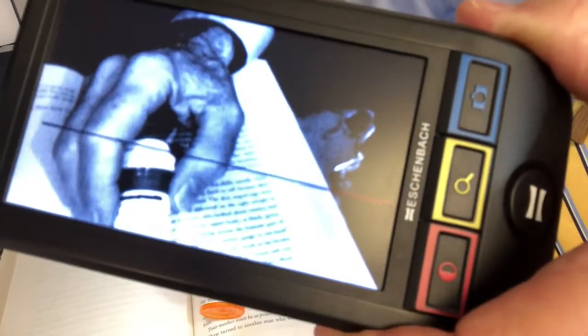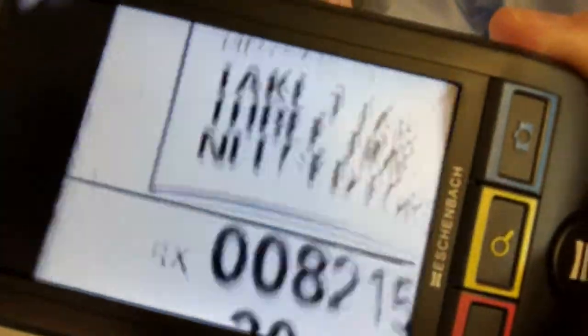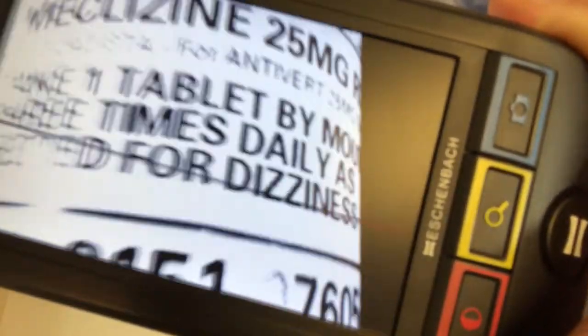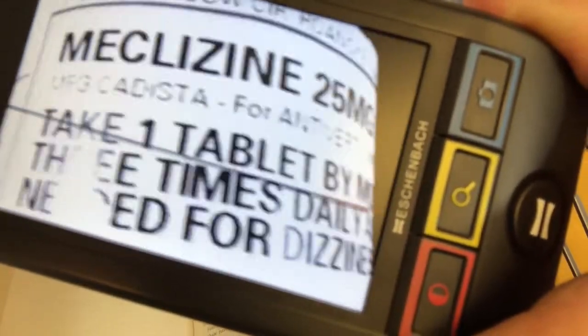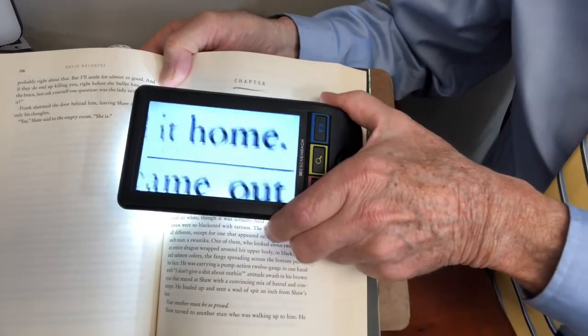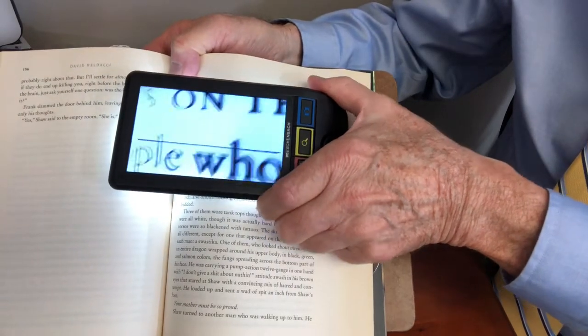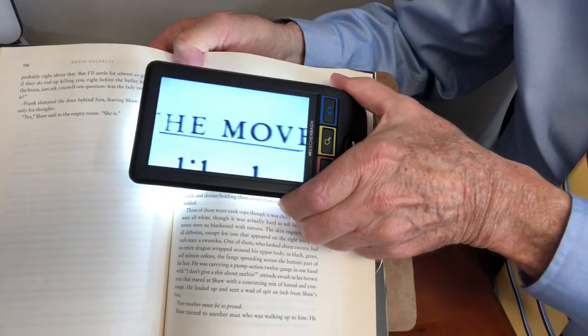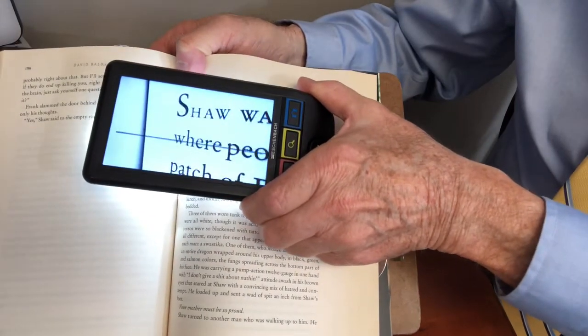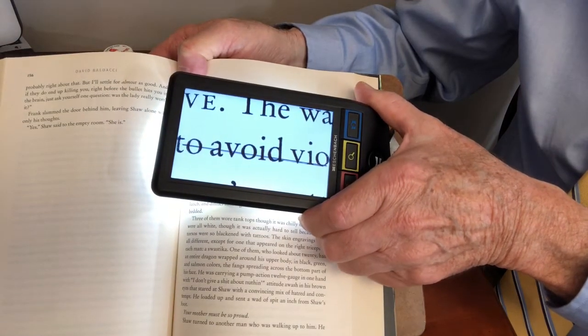This magnifier is called a Smart Lux Digital, manufactured by Eschenbach. It has the advantage of being nice and portable — you can easily carry it with you. It makes it easy to read the label on a medicine bottle, and of course you could read a book or a newspaper by placing it right on the page and moving across the line, then back to the beginning of the next line. Many people do a lot of reading using this type of device.